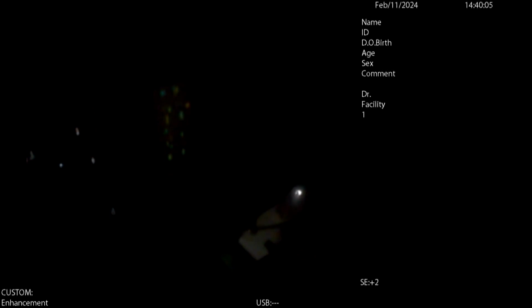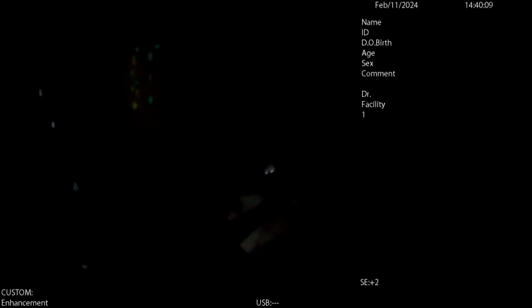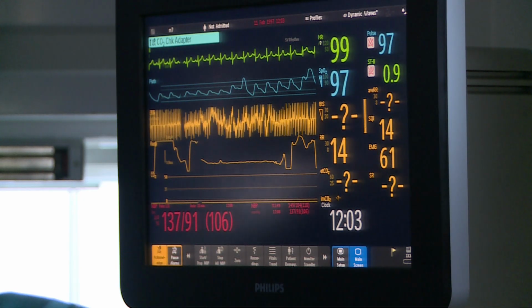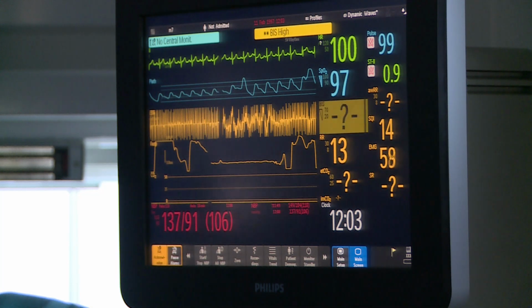Just for a second, we will wait for the dexmed effect to go in. As we are trying to do the interventional DISE, there is a chance the patient may wake. So, name sir, please.